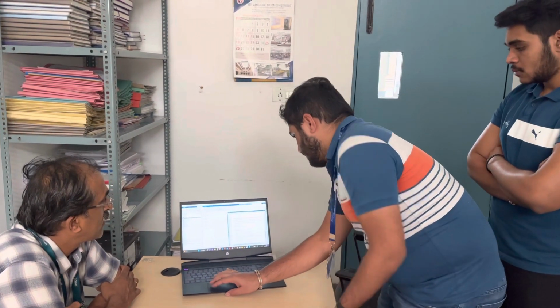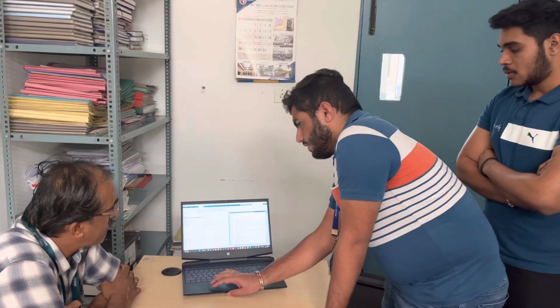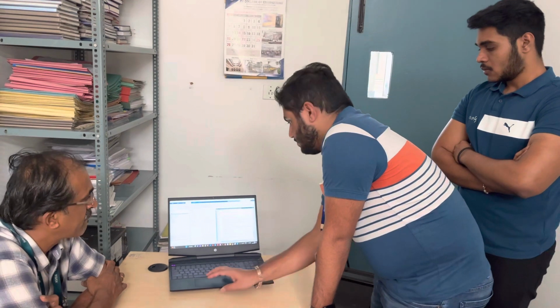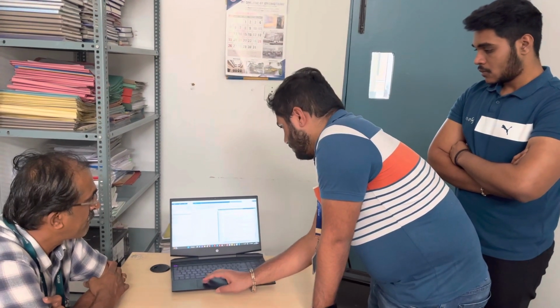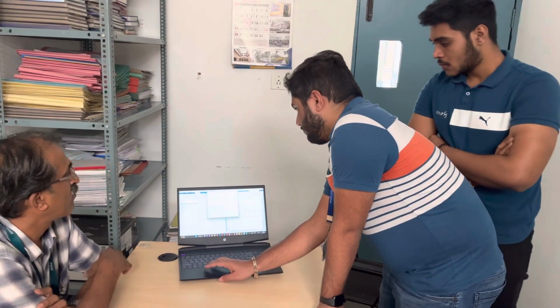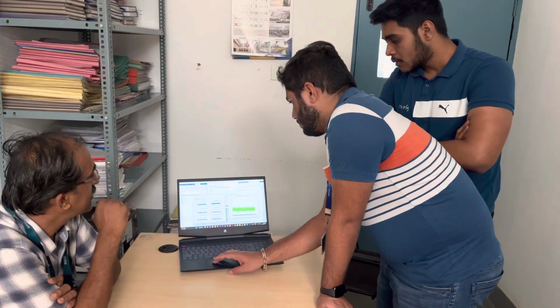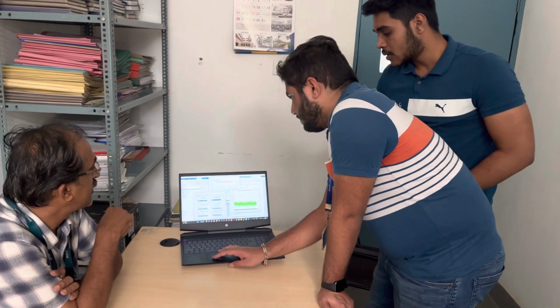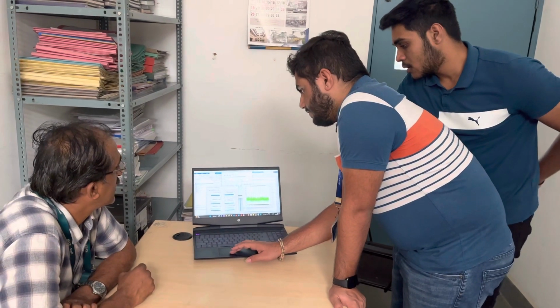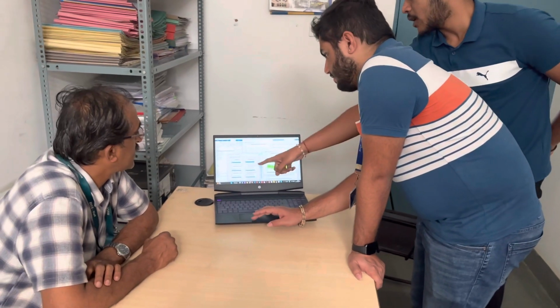So this is the code. These are used for plotting the graphs. We have used 5 basic steps: applying window, applying sampling. So this is your plotting here. When we run this code, we get 4 intermediate results: original ECG, FFT filtered ECG, then filtered ECG first phase. Then we are removing detected peaks. Here we are applying the rectangular window.